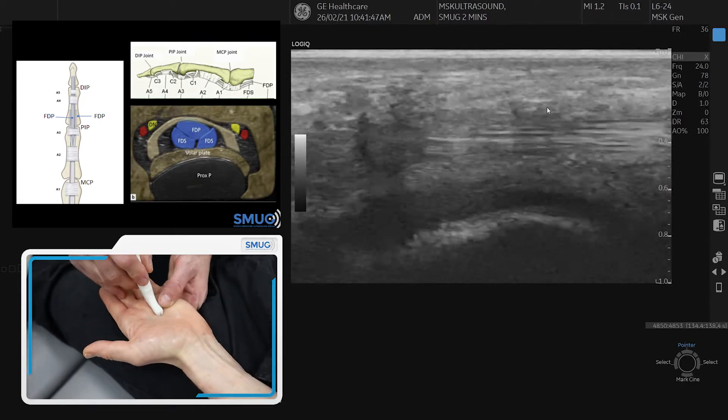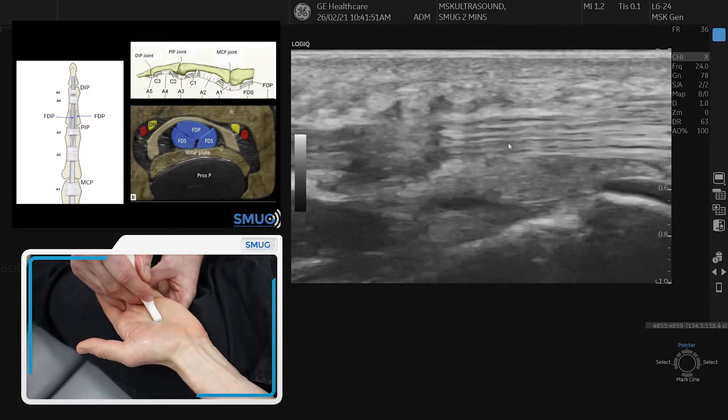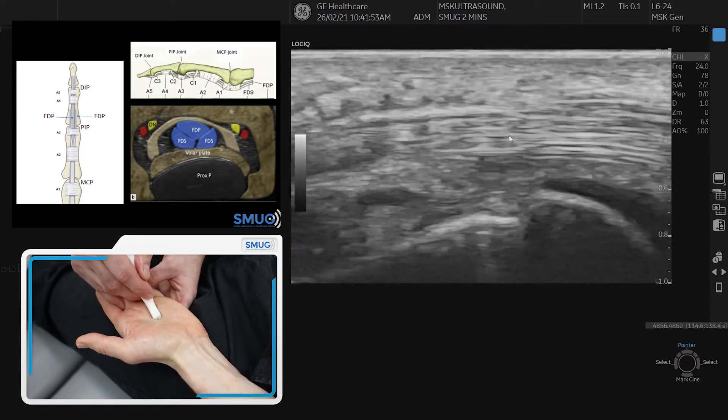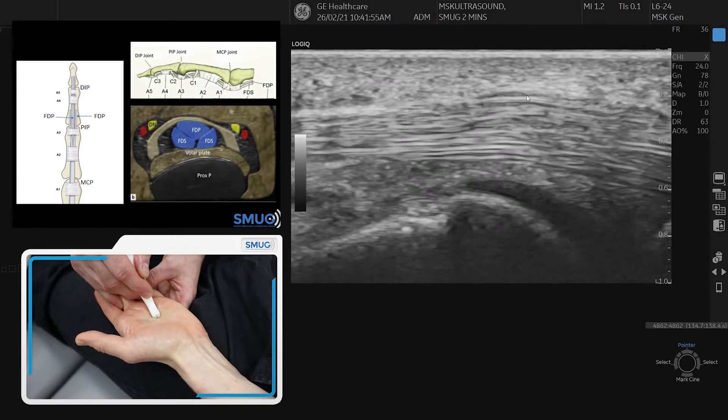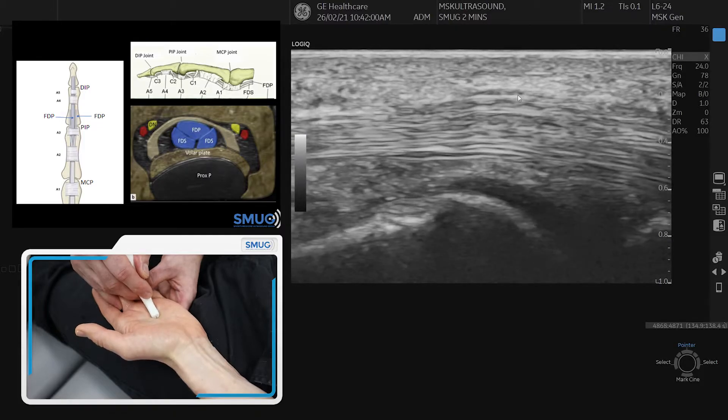Now we do it longitudinal, starting in the same place — just proximal to the MCP. Pick up the tendons there, and at the level of the joint there should be a pulley. It's quite hard to see sometimes; you have to work it hard. You can try to make a passive movement and see if you can find that pulley on top.